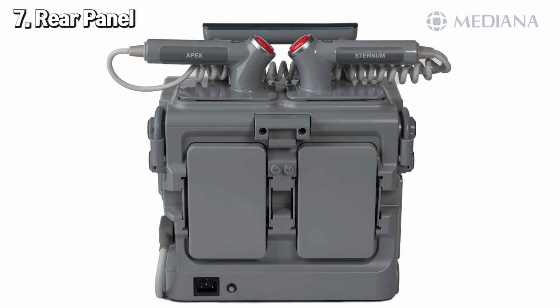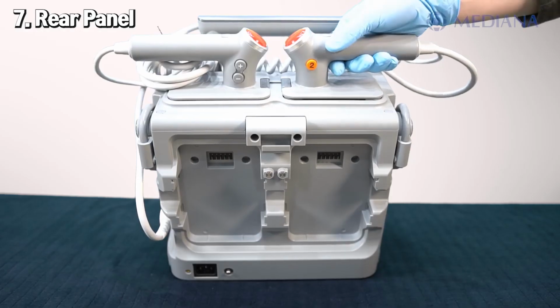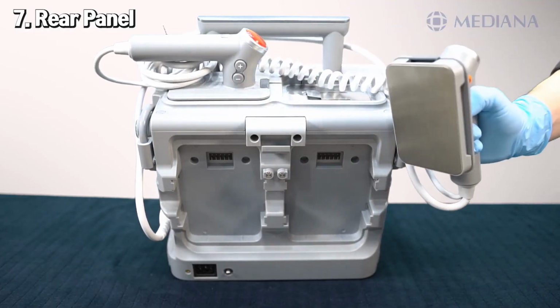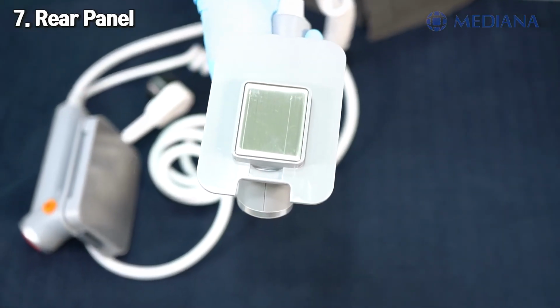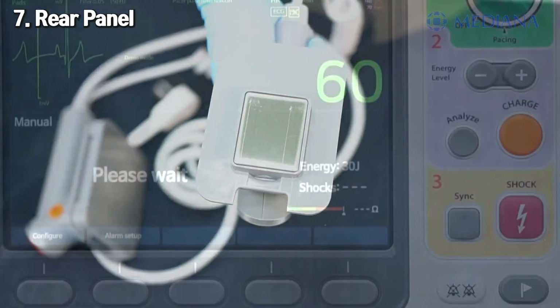If we look at the back side of the device, we have external paddles, dual batteries, and the DC power connector, which connects to the external cradle for charging. The paddle is an assembled product which is intended for use with adult patients. Remove the plate of the paddle for adult and there is the paddle for pediatric patients.